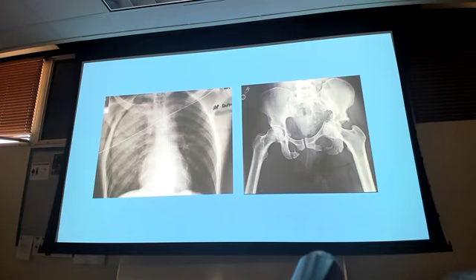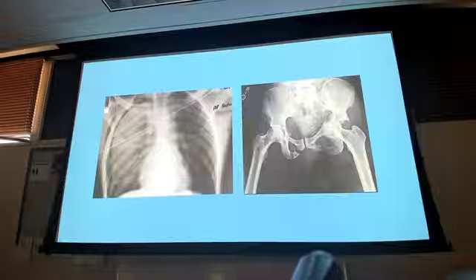But you're starting with that and x-rays. Because x-rays are quick, they can do them bedside, right? You double check some of those things, what we're seeing here, and we'll go over block 2. We got a pneumothorax here, and we got a fractured pelvis there. Don't get hung up on the pneumothorax, it's a block 2 thing, but that is something that's on there. And then pelvis, I mean, when we learn how to kind of follow the cortex and everything, we're going to see all these fractures down here in the pelvis, down in this area here.